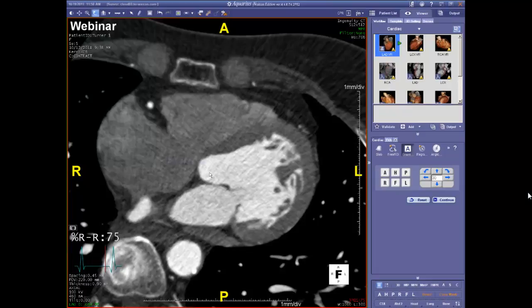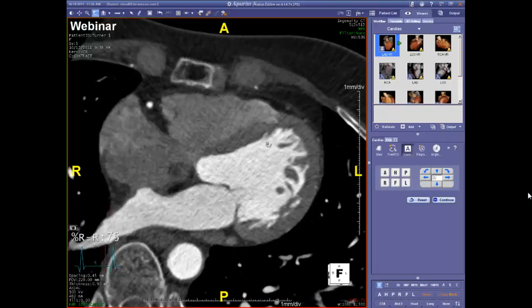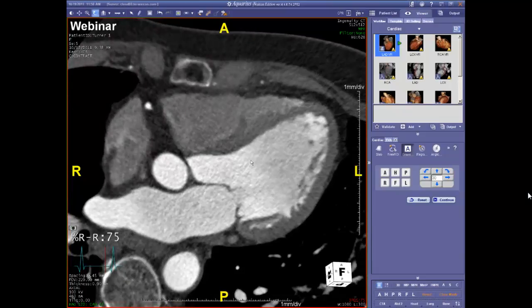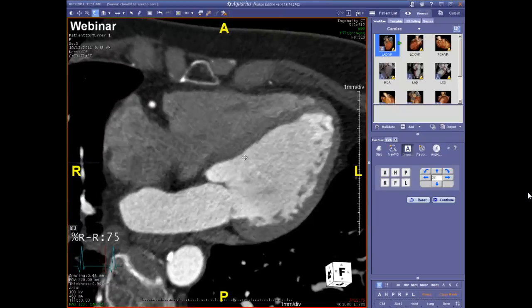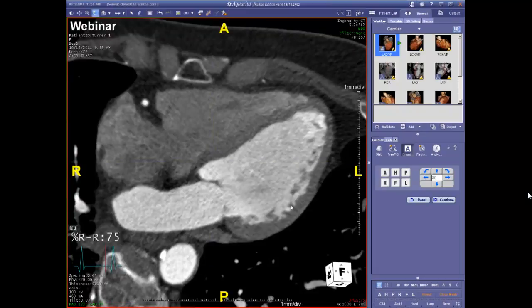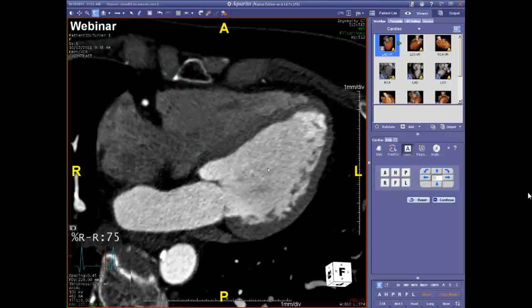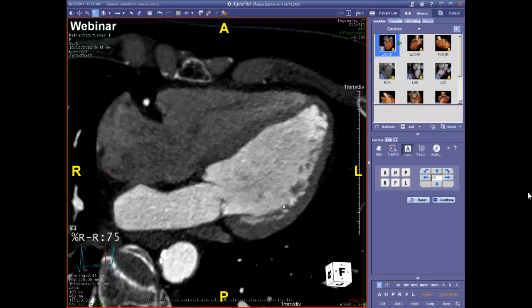Let me open this up with our tools and create sort of a four-chamber view - move slowly to get this out. Dr. Turner noted that he thought the trabeculations were exaggerated, and the crypts we can see here - I'll improve how this looks by changing the brightness and contrast. He was unhappy about the lateral and infralateral surface of the ventricle. Certainly we don't see trabeculations typically in this region - this is normally a smooth area. As we come around the apex, there are areas where the crypts are quite deep.